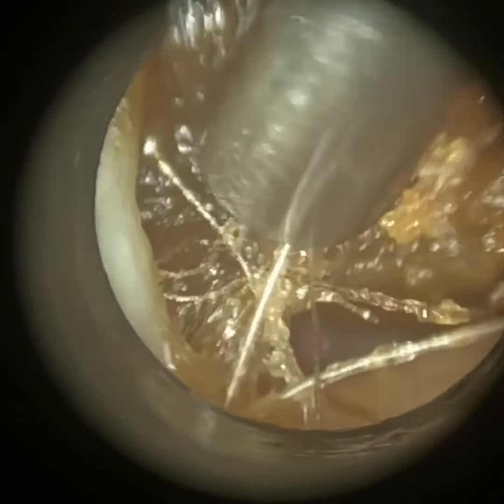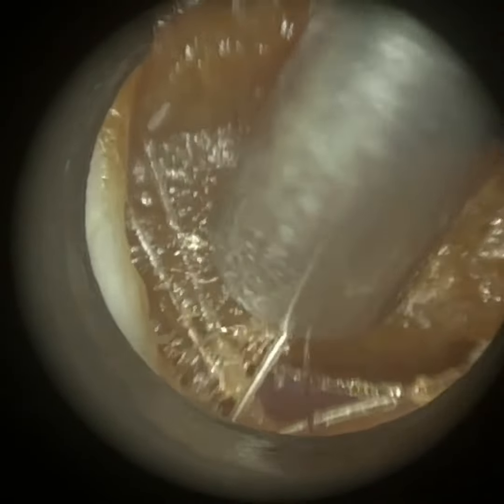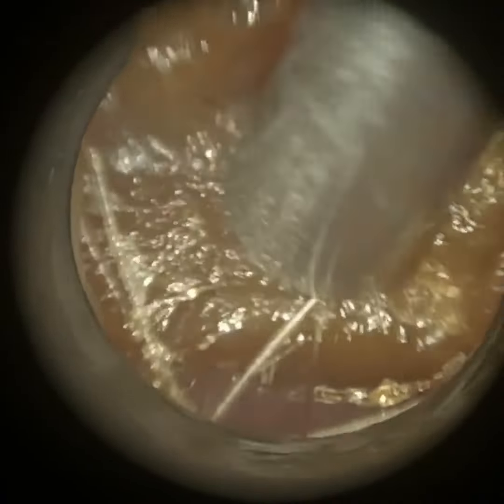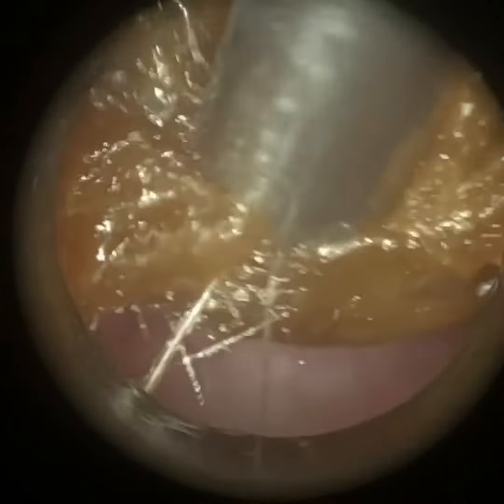I've put some oil in already. That's the first bend just to the left — it's got trapped in this region. There are a few matted hairs. Now that I've released it from there, I just mobilize the wax plug and slowly bring it away. There's slightly less keratin on this side.